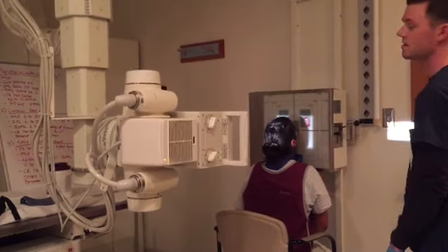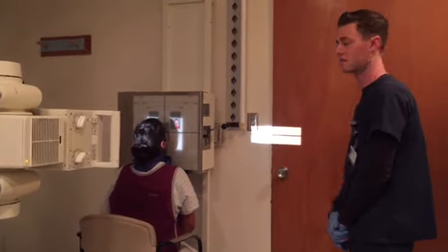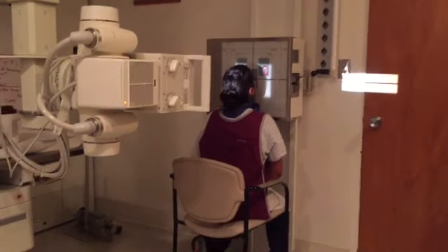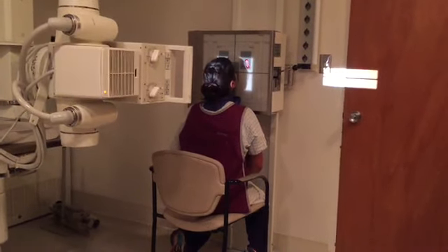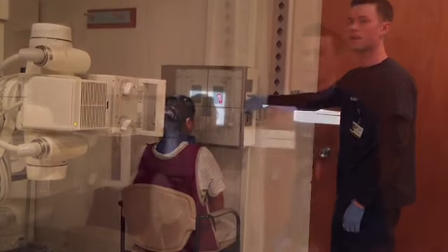For this one, I'm going to shoot about the same technique. About 75 at 8 to 10 mAs. Alright, Evelyn, go ahead and hold your breath. Don't move. Expose. Alright, you can breathe. I can set out and run it. Move on to the next one.